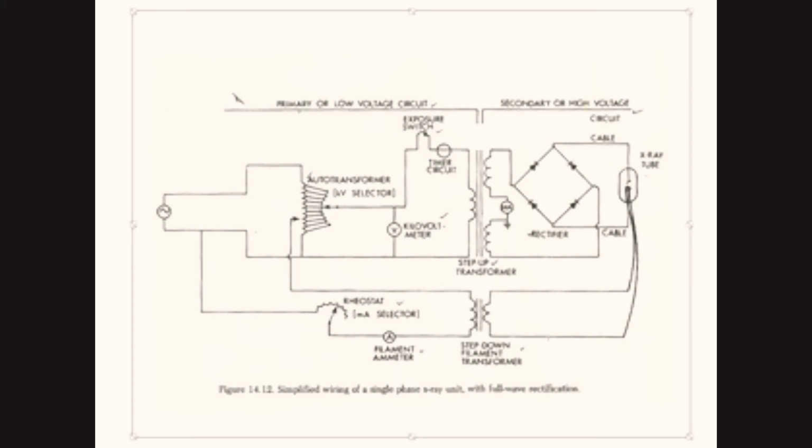Up next we have the rectifier. This is also known as the silicon controlled rectifier, SCR. And here pretty much it just changes the direction of the current from alternating, which is AC, to DC, direct current. It acts as a grounding as well, which allows excess electricity to be rerouted. So in order to not cause any fires or damage or harm to anybody nearby, it's kind of like a place where all that would go.